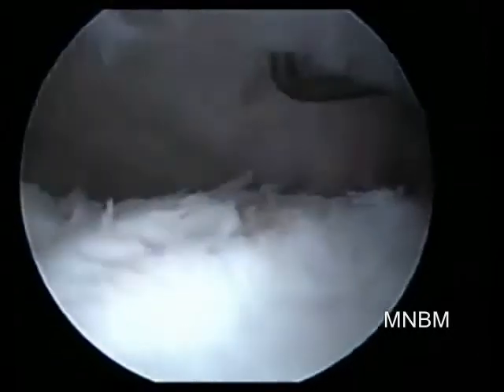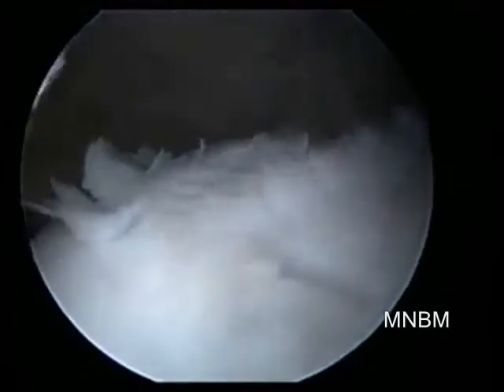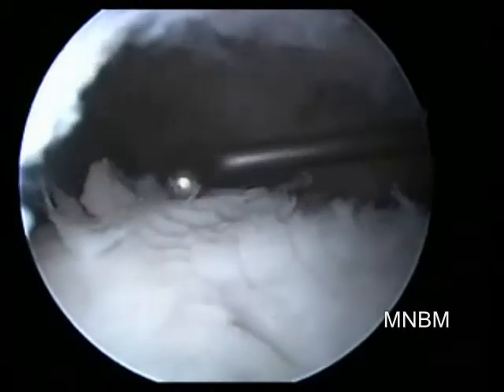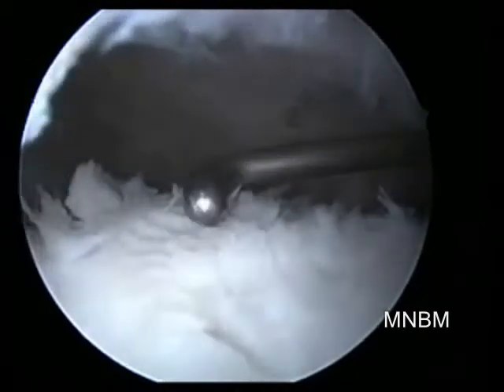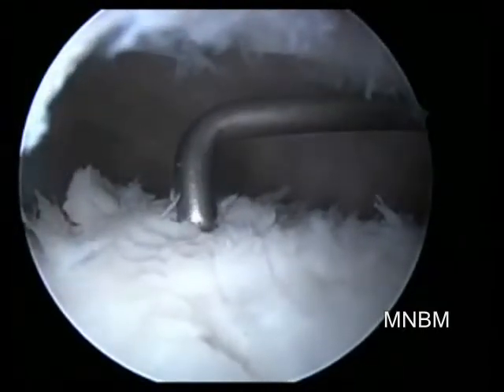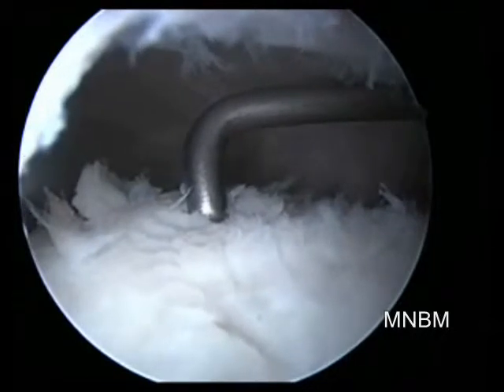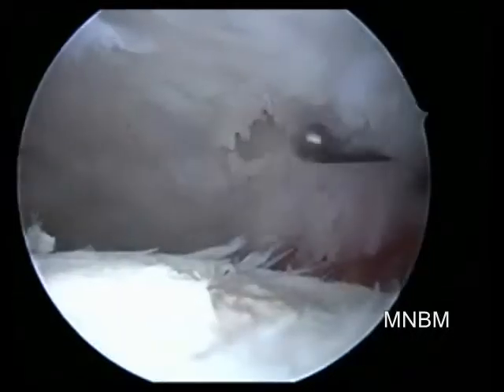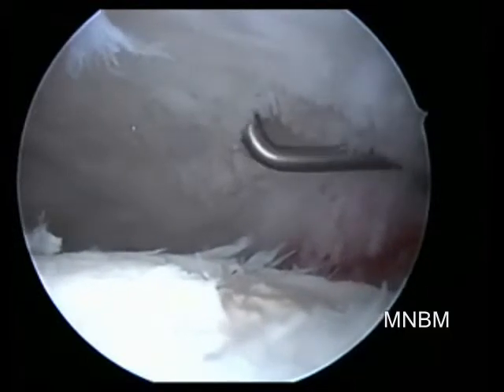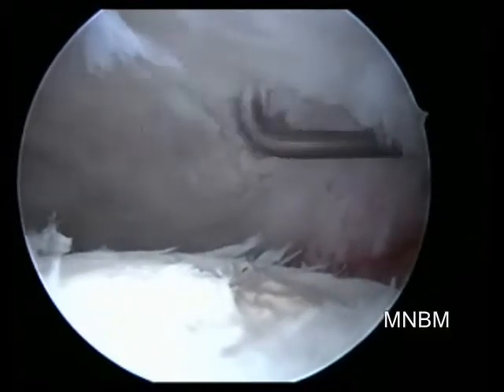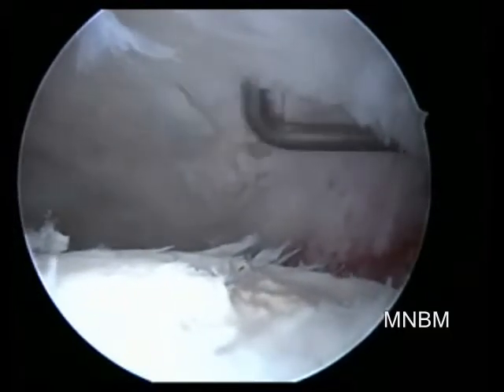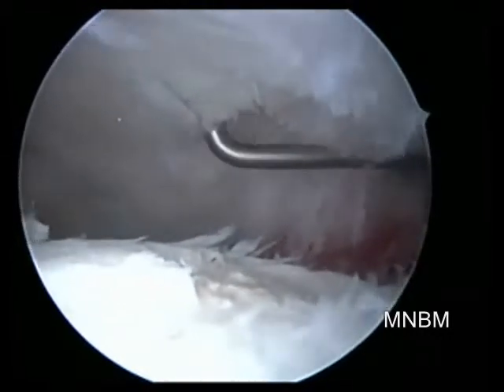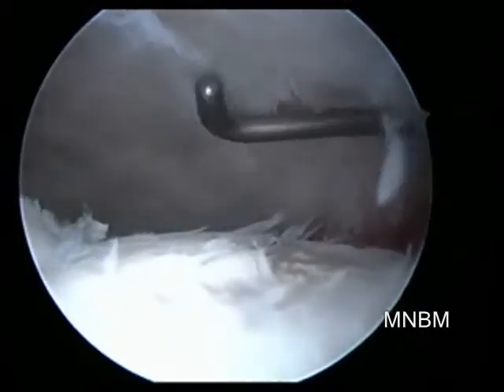What we can immediately visualize after debridement of the damaged labrum is a significant amount of damage in the acetabular and femoral margins. The acetabular superior cartilage has been peeled off and delaminated, and there is grade 4 damage to a large area of the acetabulum and the femoral head cartilage.